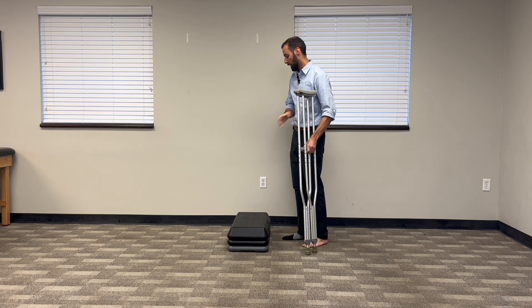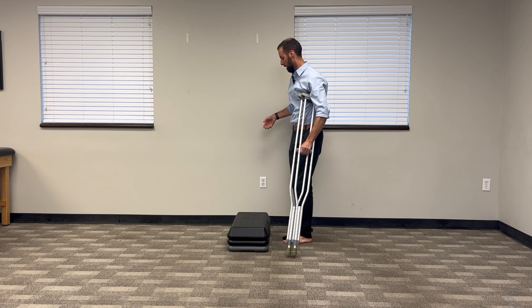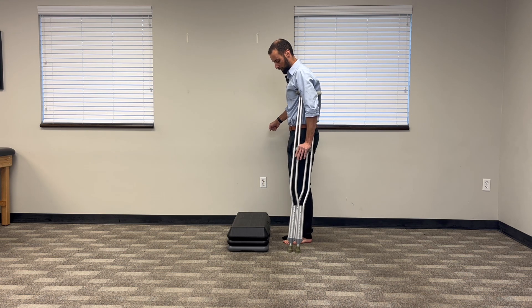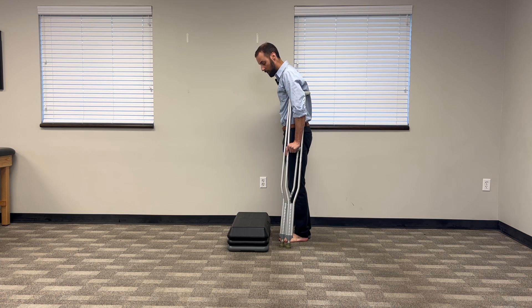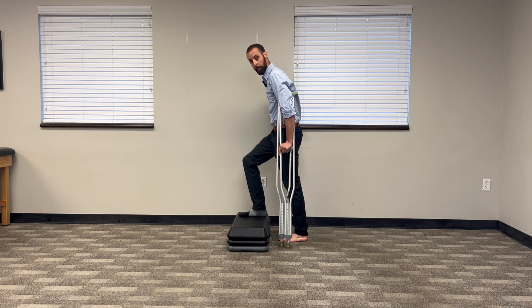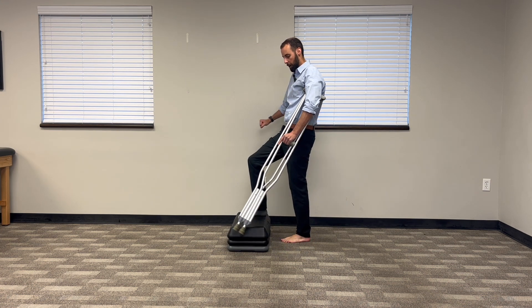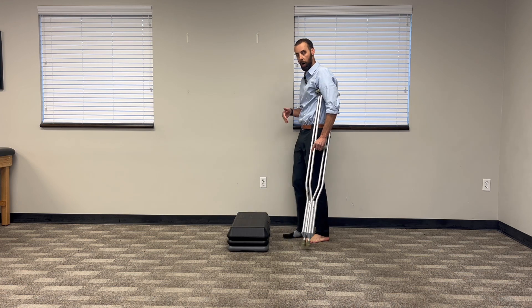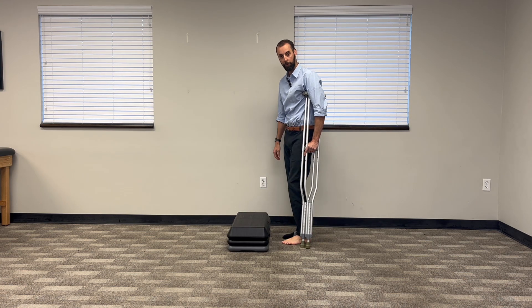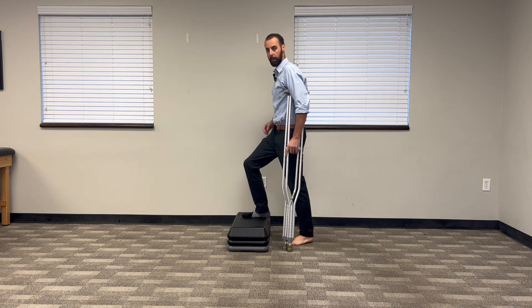Now, if you have a railing on this side, I want to make sure you don't make this mistake. You have a railing — you want to keep the crutches with your bad foot. You can use the railing and the crutch and get your good foot up like that. Do not use the railing, bring your good foot up, and then the crutches — it's going to pole vault you back down the stairs. Always keep the crutches wherever your bad foot is.